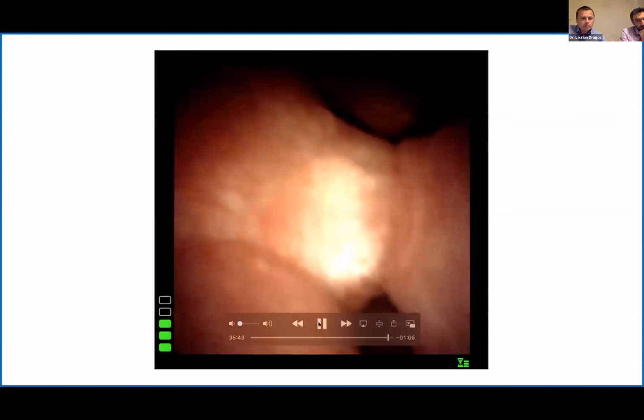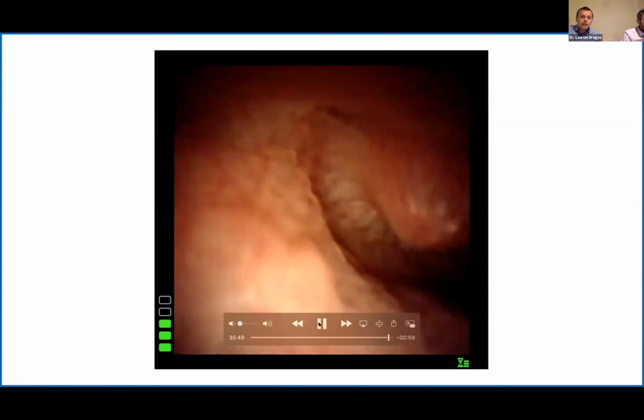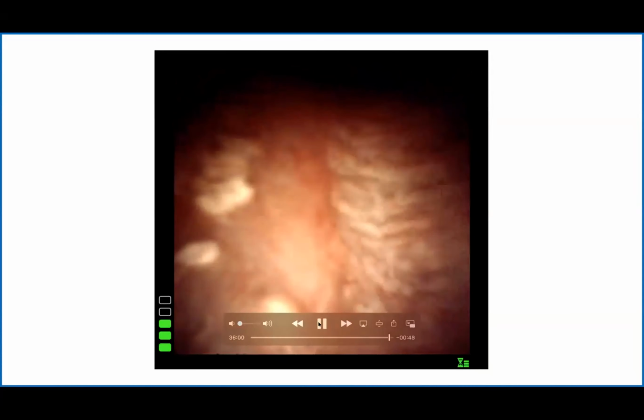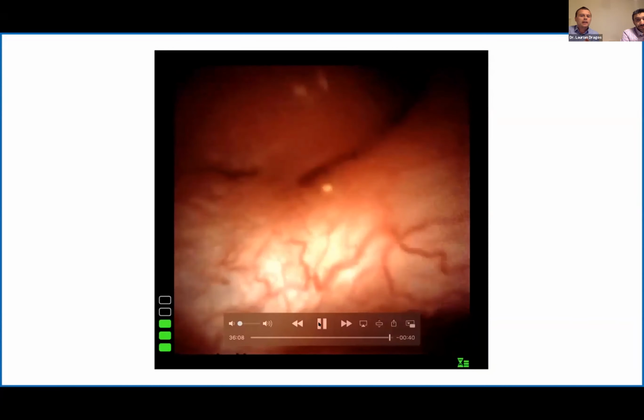And I would like to make a comment at the end, because obviously this is not perfect surgery. As I said, now I'm just checking the rest of the collecting system, which is collapsed now. Yeah, it looks good. Just some Randall's plaque. Look here. You can see there's not a lot of pressure, and you can see the fornix almost on the verge of breaking.